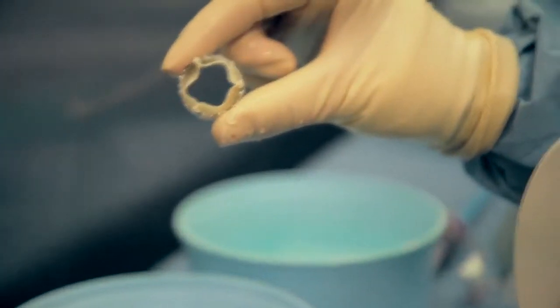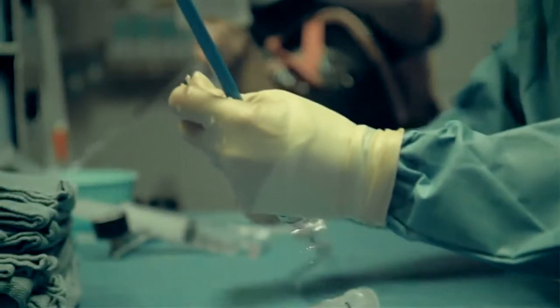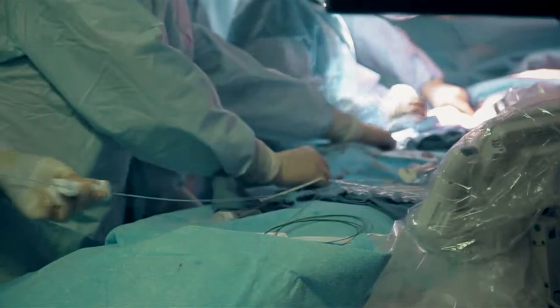Other risks, which are low risk, but they do exist, are stroke or injury to coronary arteries causing heart attack at the time, or bleeding from the aorta when the new stent is placed, crushing the old calcium out of the way. This can disrupt the aorta itself, the main artery, and that can lead to bleeding. We will spend a lot of time trying to prevent these complications and addressing them, and your doctor will discuss them with you to make sure that there's nothing different that you would want to do during the TAVR if a complication were to occur.